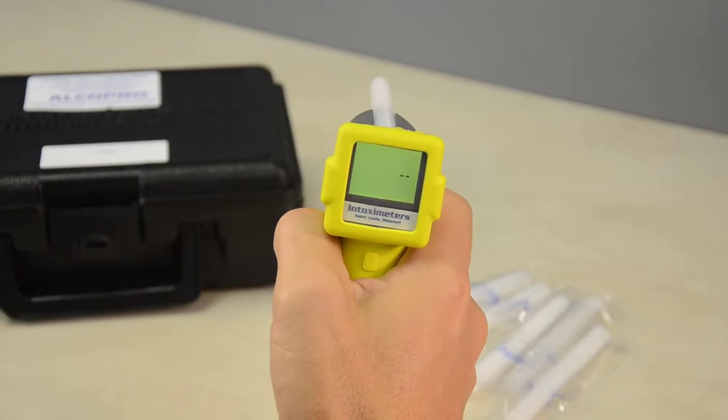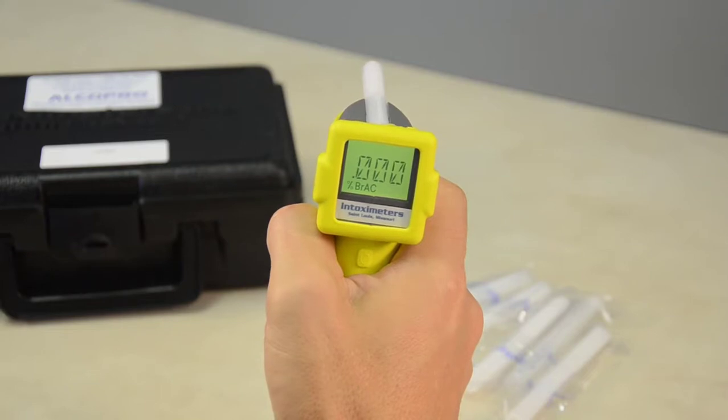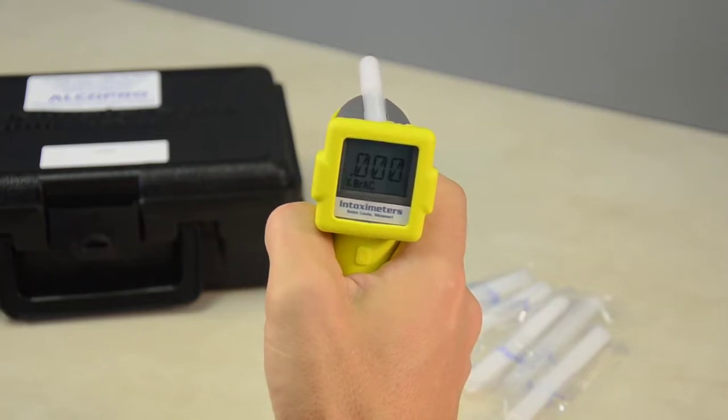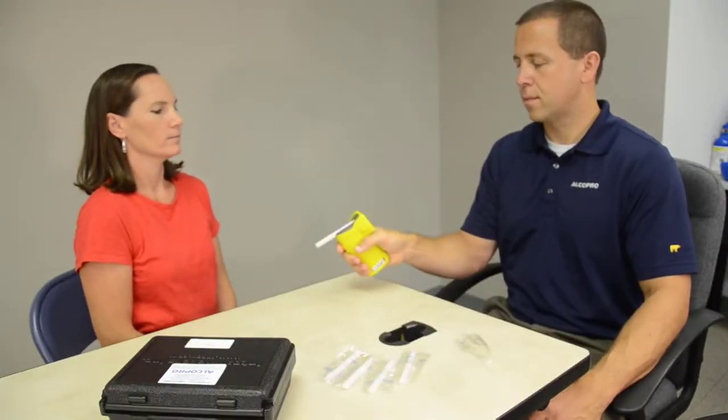Once a breath sample is captured, a dash scrolls across the display, which means the device is analyzing the breath sample. Next the AlkaSensor FST will display the results. The test results display for 15 seconds before the instrument automatically powers off. You may also press the OFF button to turn off the instrument.